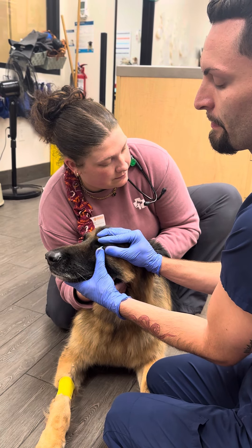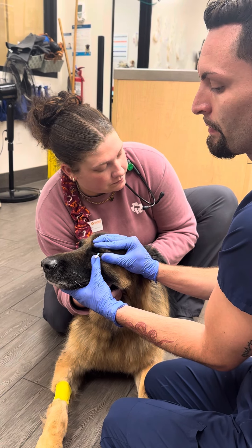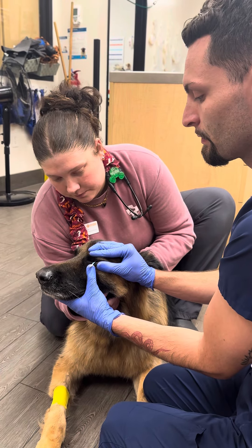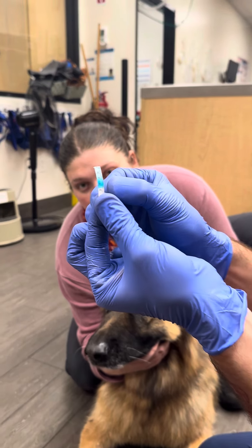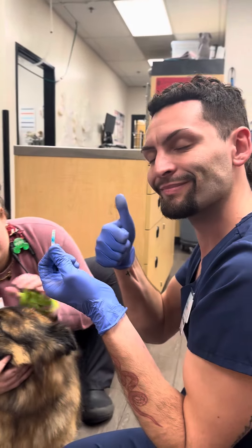I'm almost done. I know. I'm gonna go home soon. 15 more seconds. I'll stop that and then I will remove slowly — I got about 22 on the left eye.